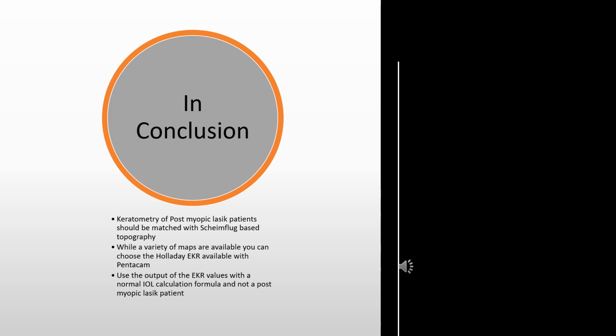And as I talked about, you could well go ahead with the Holladay EKR map, which is there in one of those Scheimpflug based topographers. That's the Pentacam.